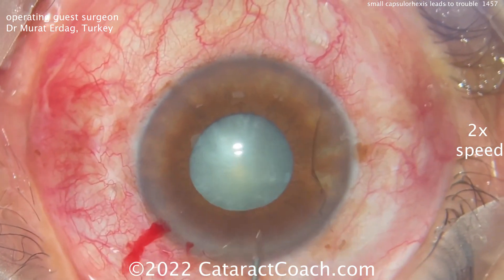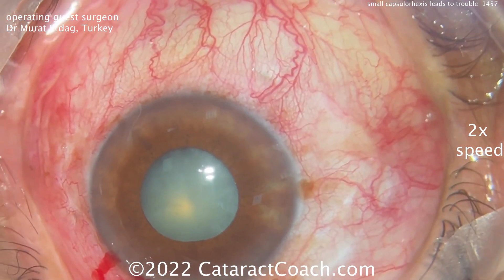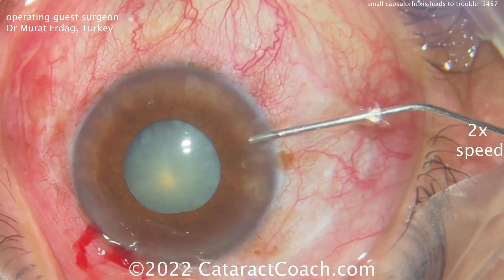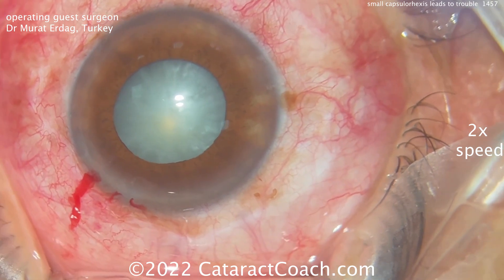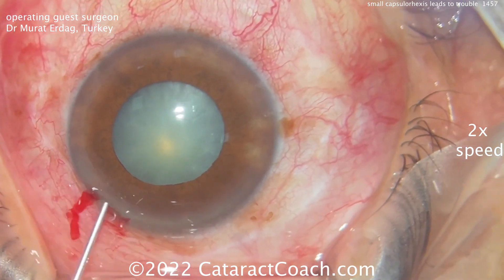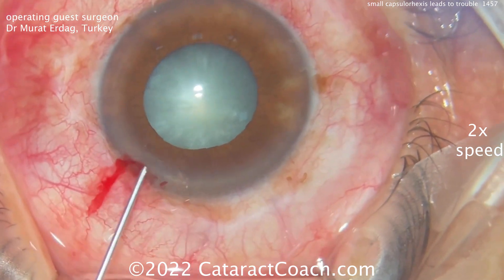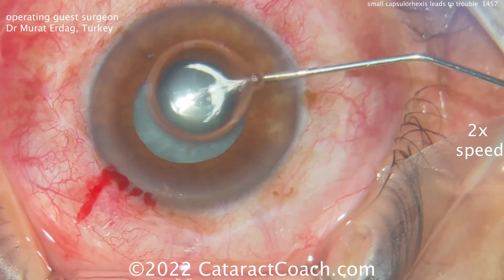We've sped up the video at two times normal speed just to show you everything. Can you guess, even at the beginning, what complication we're going to encounter with a small pupil and small Rhexis? You can see dilation is a little bit better now — maybe some phenylephrine or epinephrine was placed inside the AC, maybe some lidocaine, which can help get the pupil a little bigger.